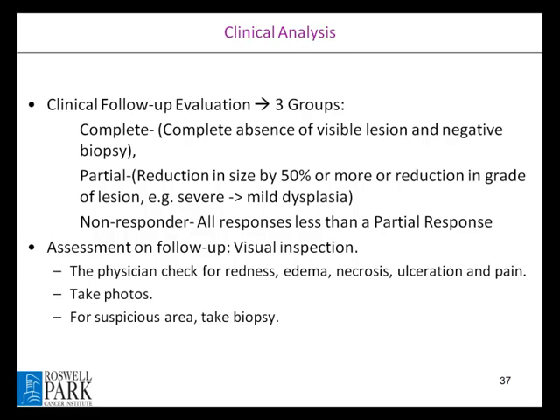That's something I will also try in future work. It would be really interesting if we can image it, and also if we can do it continuously, which we cannot do yet. Optical imaging wise it isn't the problem, but technique wise, in the operating room, when the MD tries to put in the PDT dosimetry fiber, you don't want to accidentally touch your imaging fiber and sabotage it.